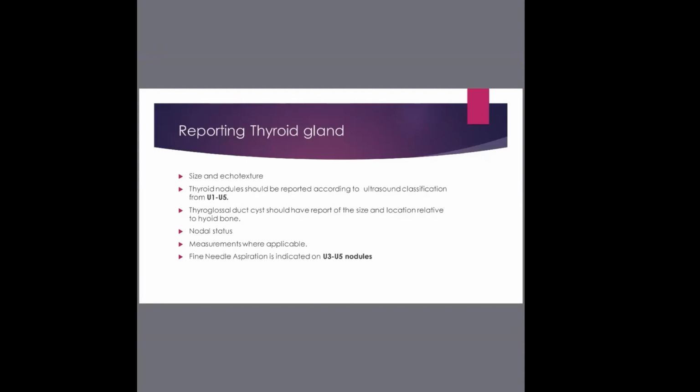Sometimes you can advise the doctor and say, you know what, this patient might need this other examination. But I must mention that ultrasound is the best modality for thyroid, because from experience, we see that CT scan and MRI might see a nodule, but they can't class it. They just know there's a nodule there, but they can't say if it's malignant or a benign nodule.